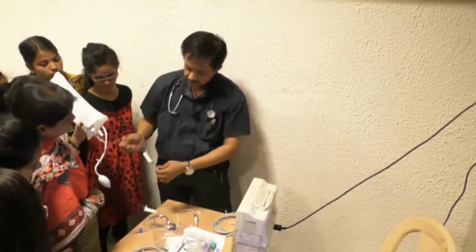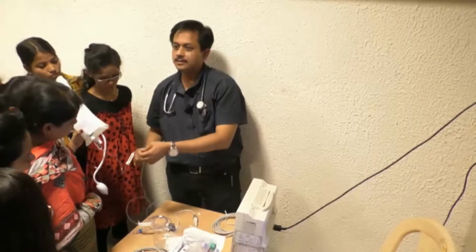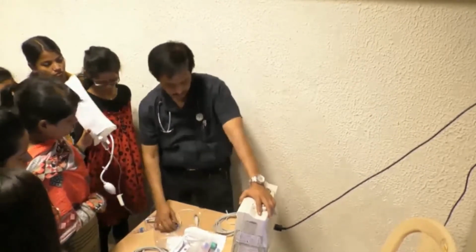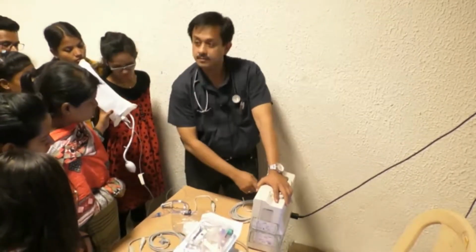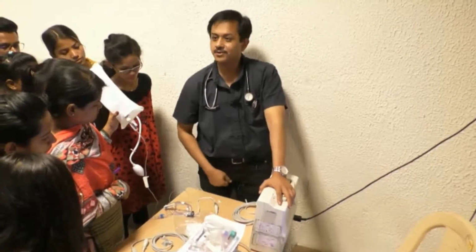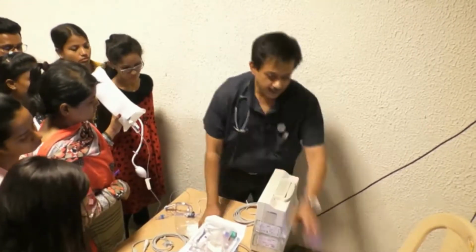In this system, there are a lot of air bubbles I can see. There are a lot of kinks here. So if I do a flush, see, it has come back to the baseline. This is an overdamped system.